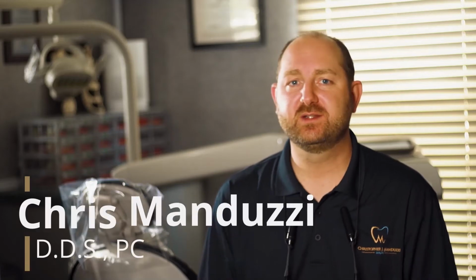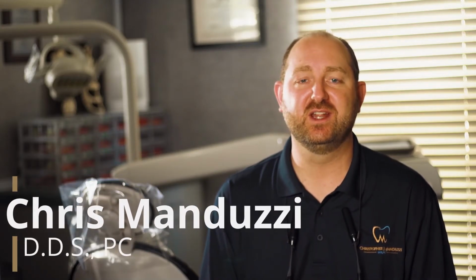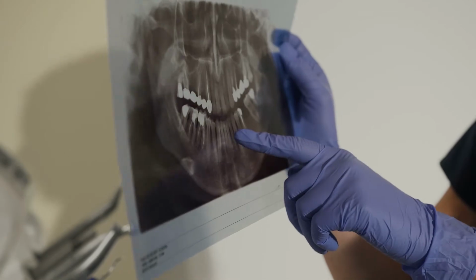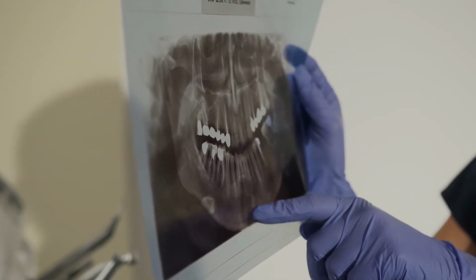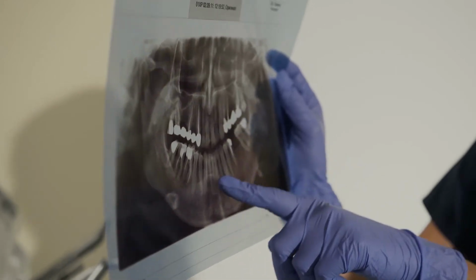Why do I need x-rays? We in the dental field hear this question on a daily basis. X-rays are the primary method for diagnosing the majority of conditions we deal with in dentistry, including cavities, gum disease, and various types of dental infections and pathology.